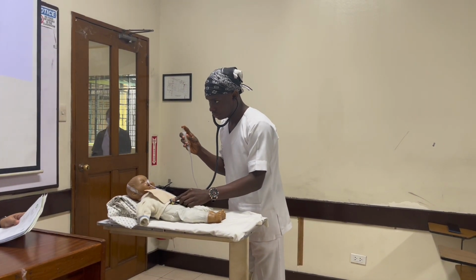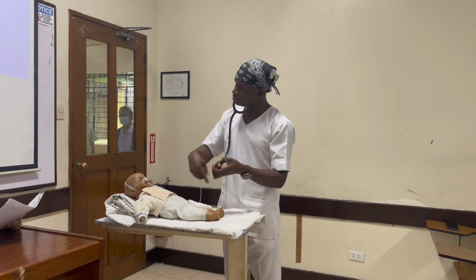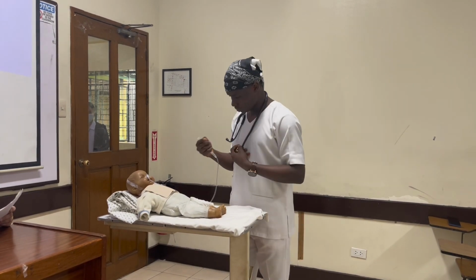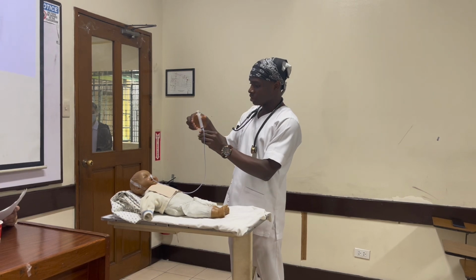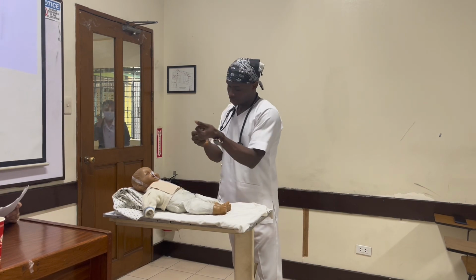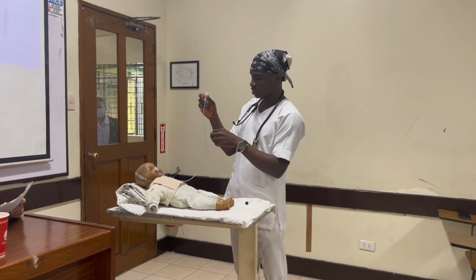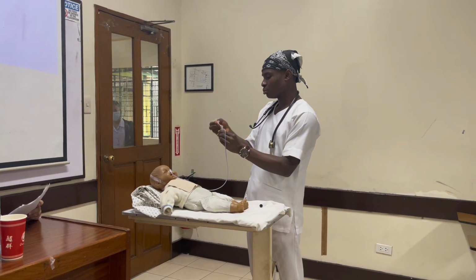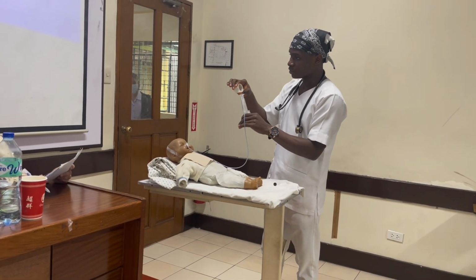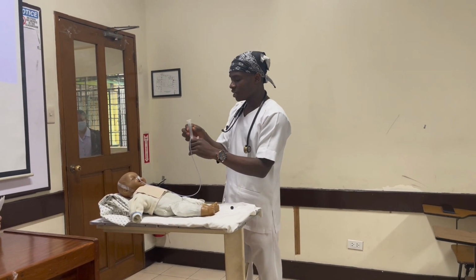Then I aspirate. When it's done, I should hear gurgling to show that it's correctly placed in the abdomen. Then after that, I kink again, take out, close. Then this is now time to take out the plunger. So what is necessary now? To kink again, open, release. Before you release, you add a little quantity of water, about 5 cc. So you add water, then you release.